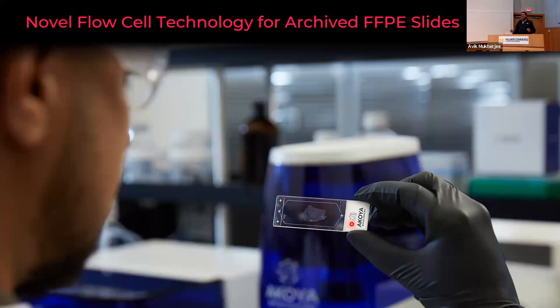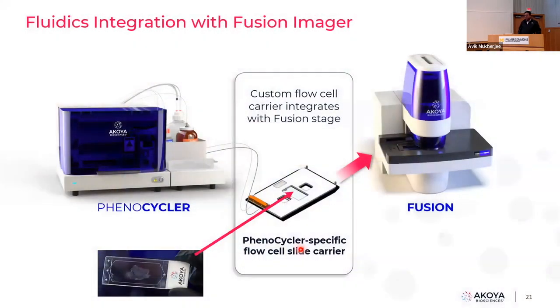I just want to mention that this slide is just a simple 1x3 histology slide, positively charged, so that you can have the tissue on it. You put the flow cell through these holes in the flow cell, the fluidics will be going through. Then you put the flow cell in the flow cell slide carrier. The slide carrier goes into PhenoImager-Fusion. There are tubings which are connecting the PhenoCycler to the Fusion.